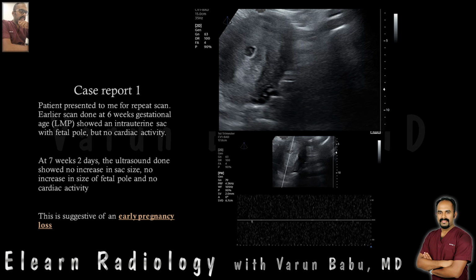Let's have a look at a few cases. The patient presented for a repeat scan to me. The earliest scan done at 6 weeks showed an intrauterine sac with fetal pole, but no cardiac activity. This scan was done at 7 weeks 2 days, which showed no increase in the sac size, no increase in the size of the fetal pole, and still no cardiac activity. So we have an interval scan done after a week, and still there is no change in the size of the sac or any detected fetal cardiac activity. So this is suggestive of an early pregnancy loss.